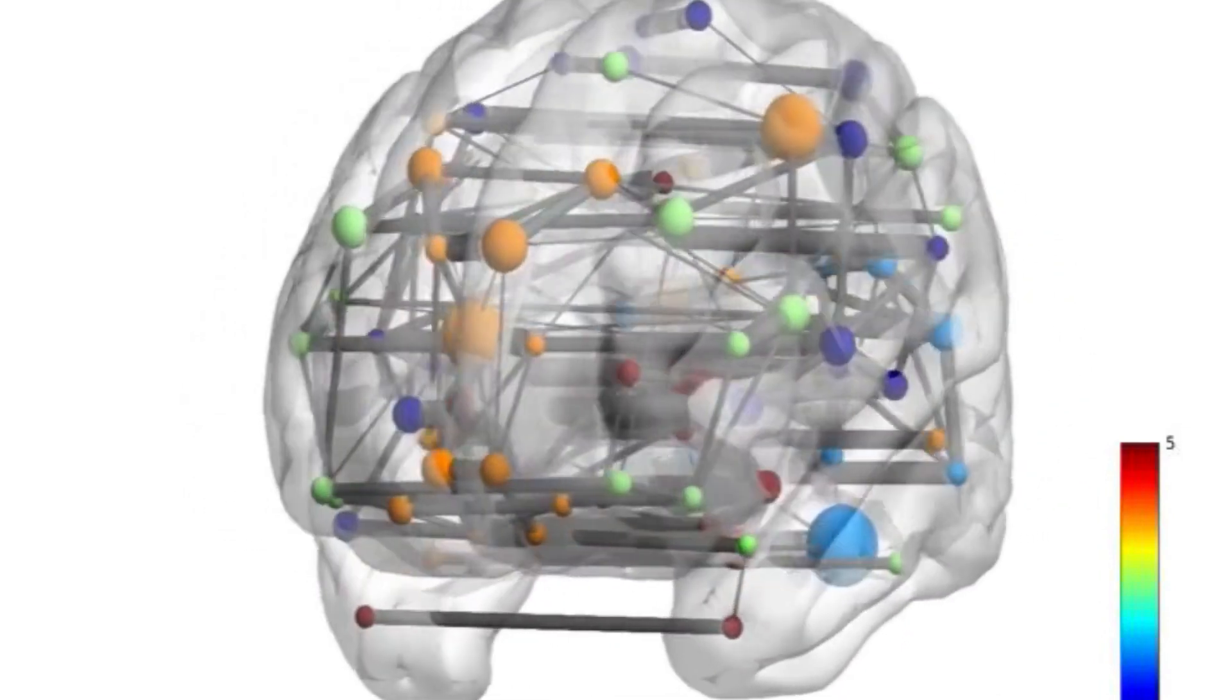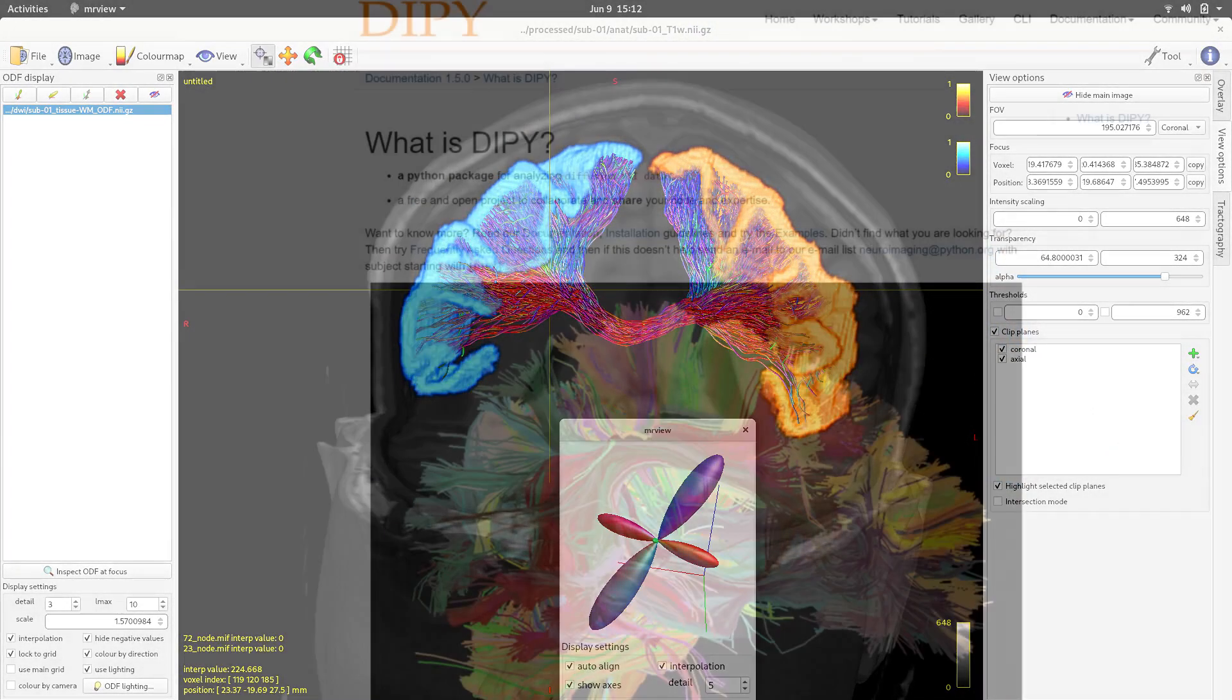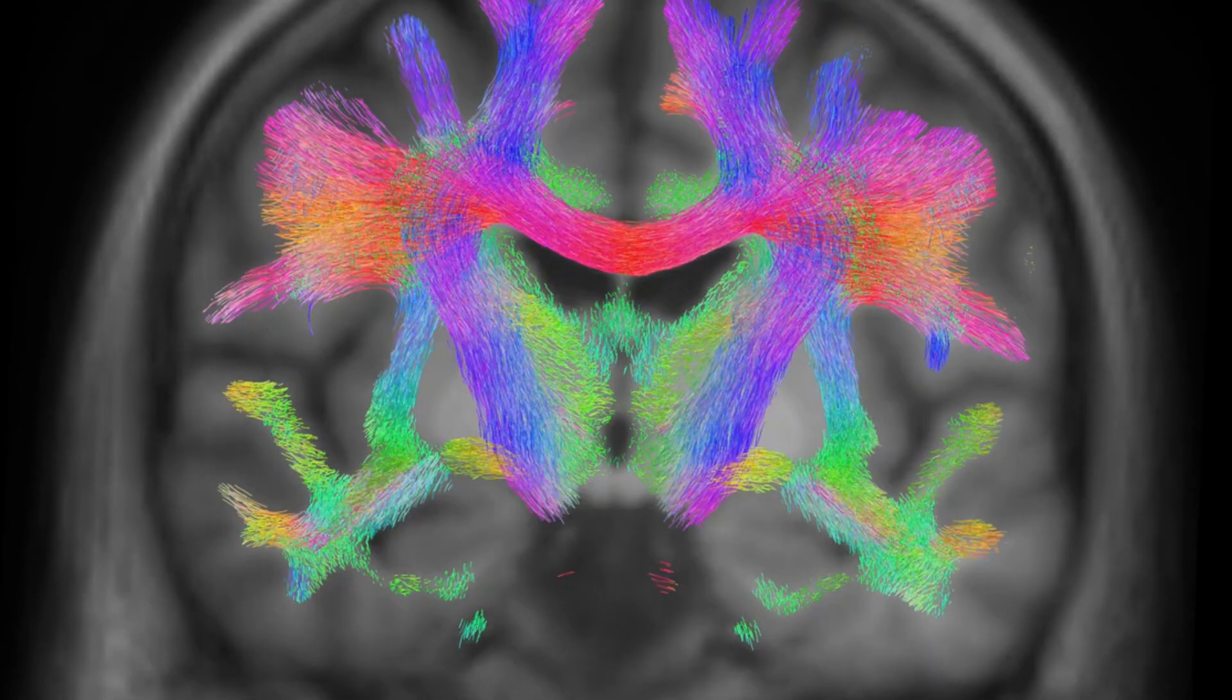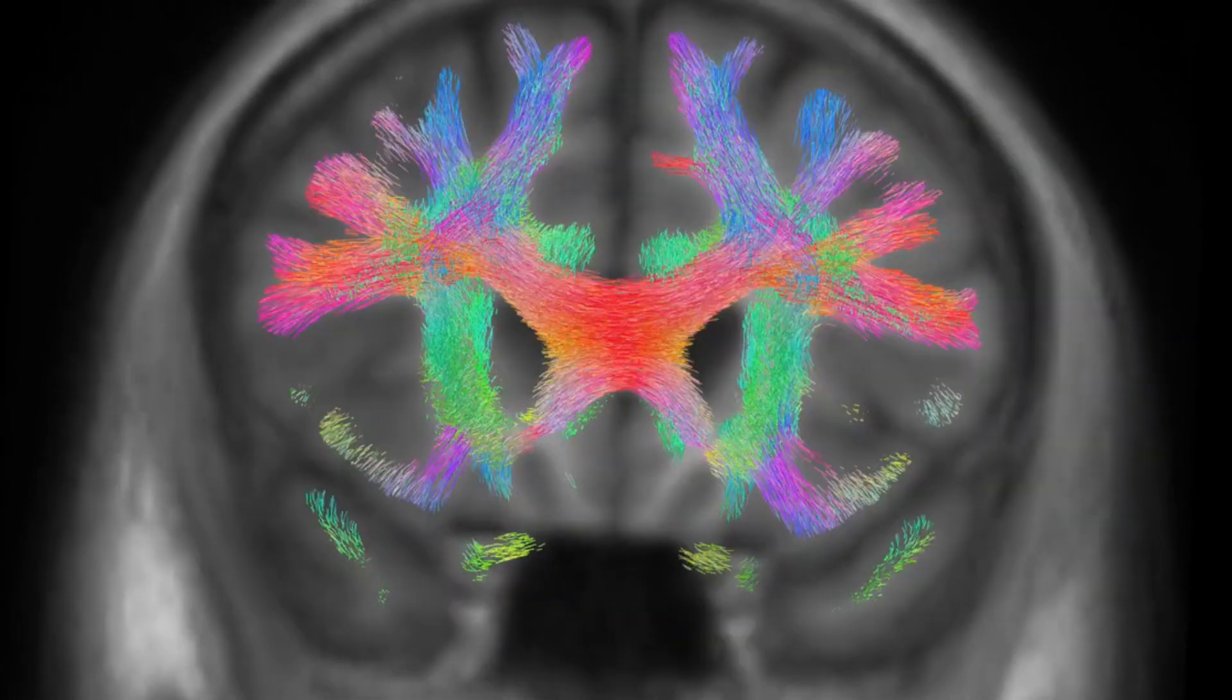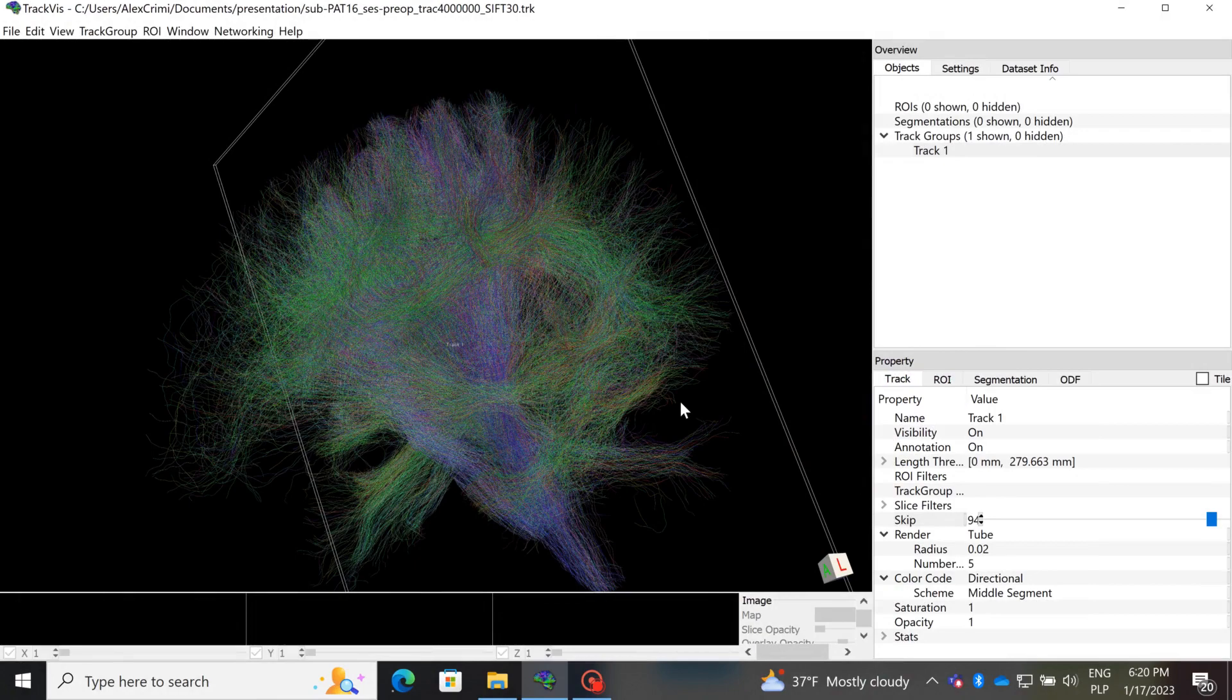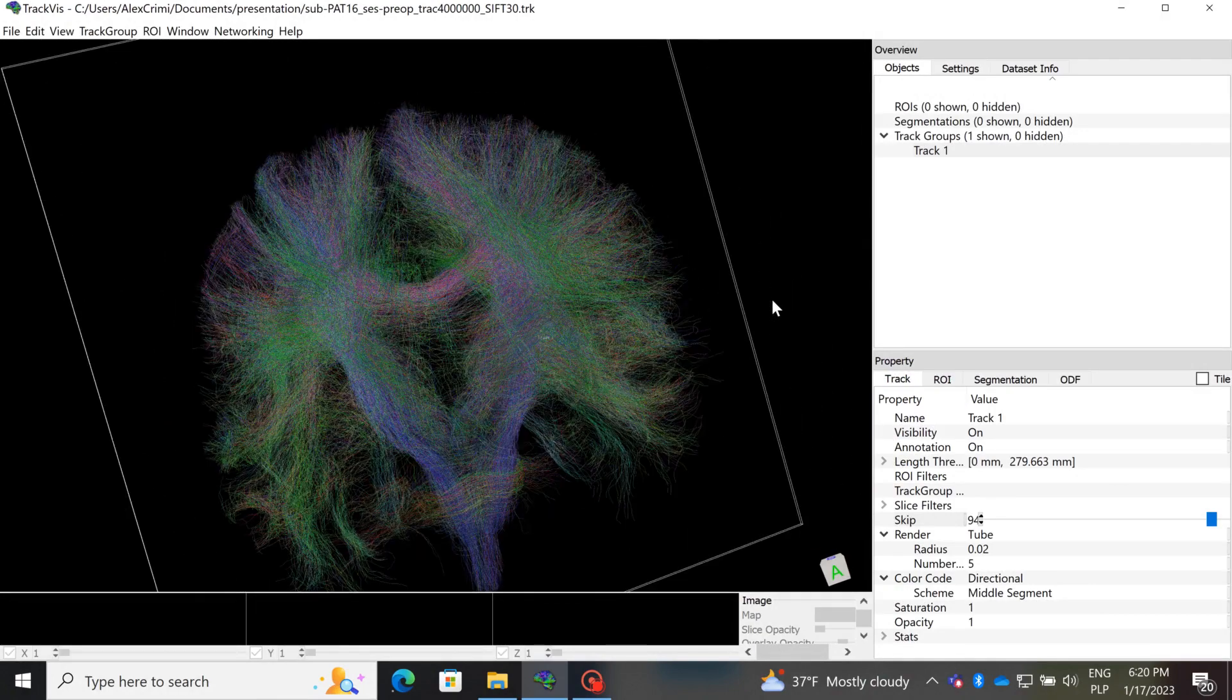We process data through tools like MRtrix or Dipy. And to render results we use either the tools that are available from MRtrix, Dipy, Fury itself, or other tools like something called TrackVis. Those came handy and everything is ready.